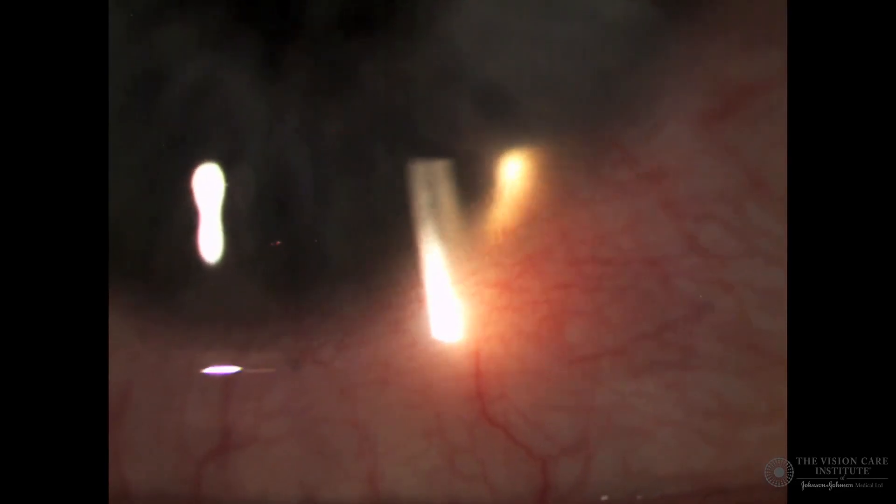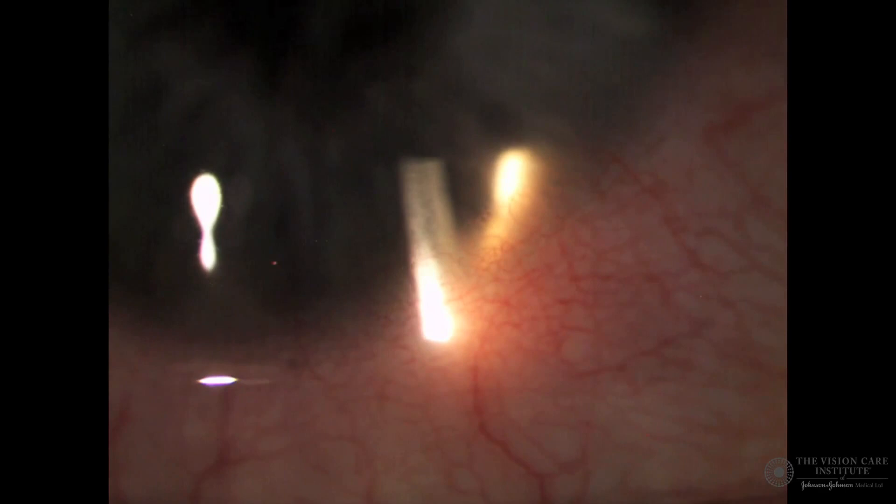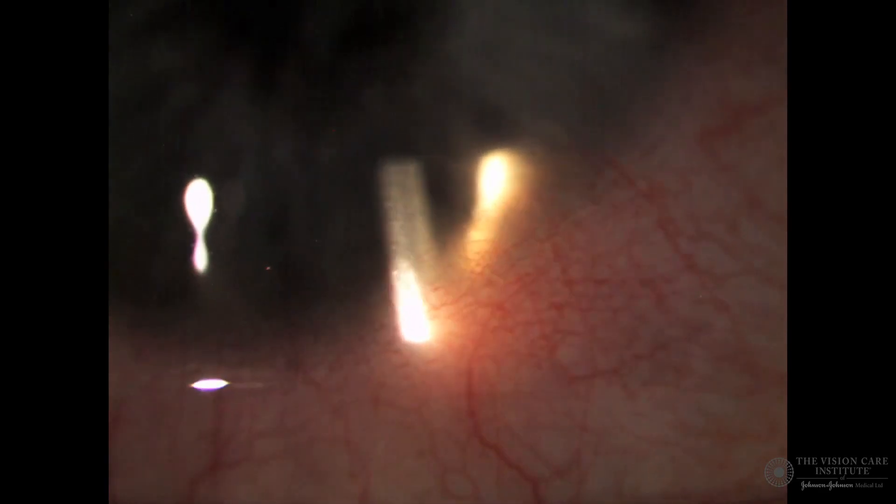When practising this technique, it is a good idea to try and do this on a person with a green or blue coloured iris, as the blood vessels are rather more visible against the blue-green background. Also, the light created by the reflection of the green iris will in essence be red free, thereby increasing the contrast of the blood vessels we are trying to look at.